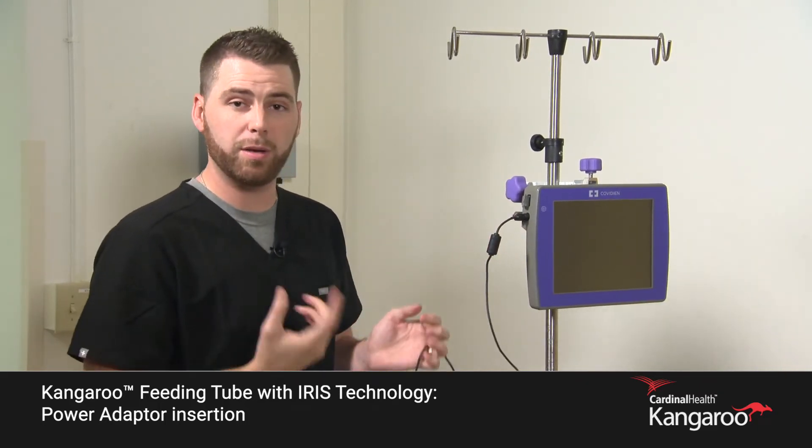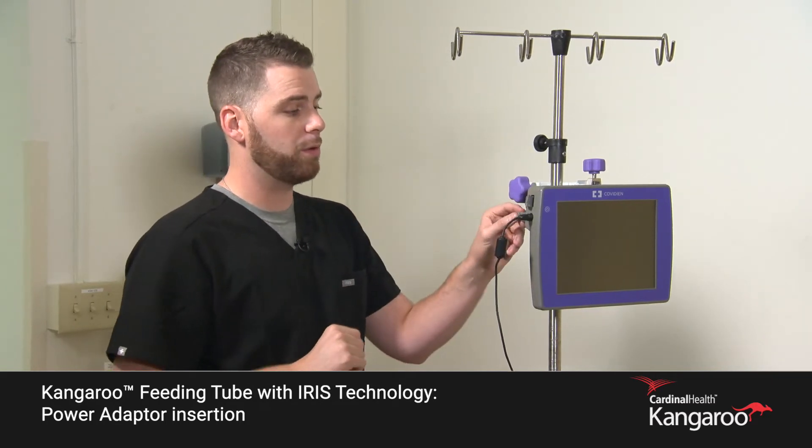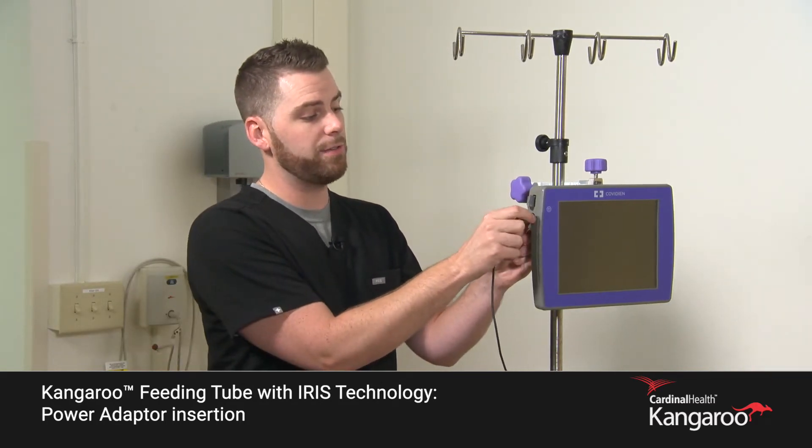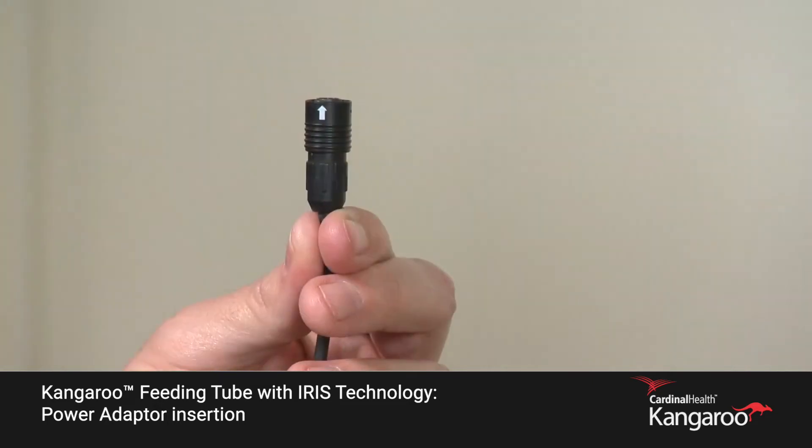You will hear a clip or a snapping sound when it's in place. To remove, you need to pull back the sleeve to release the connection and disconnect.